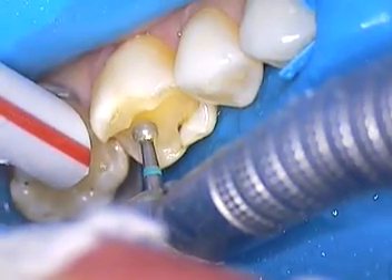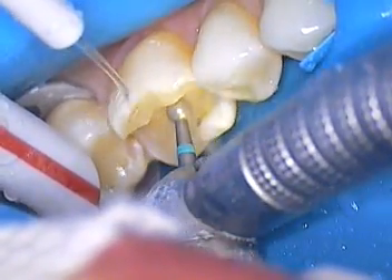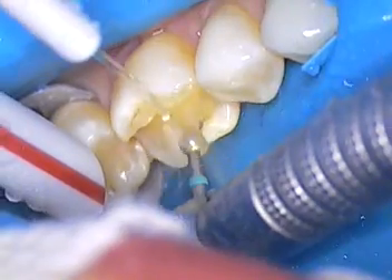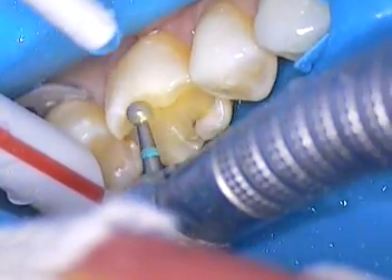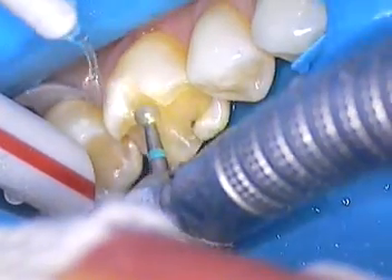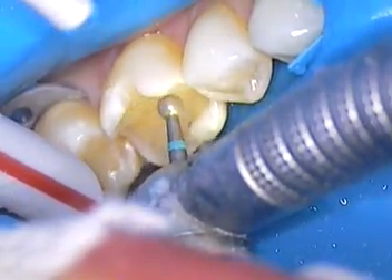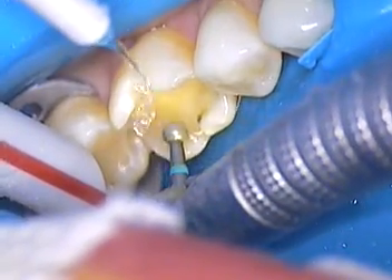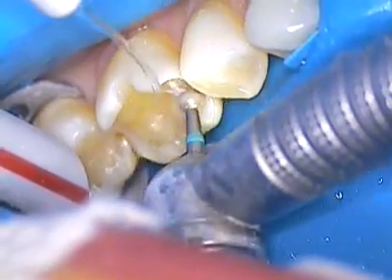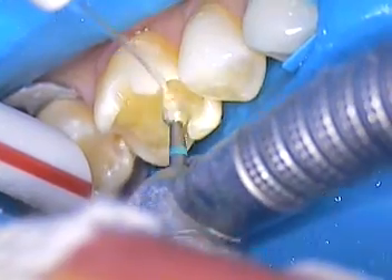I'm using a ball diamond because I know the diameter of this ball diamond is 2 millimeters, so that's my depth cut. By doing that, I'm still within the parameters of her filling material or composite. We're going to come right through the buccal and lingual grooves and open it up a little bit more. In the process of doing so, I'm removing some more of her composite. Now, composite is dentin color — the dentin shade — so it's going to make it a little difficult.